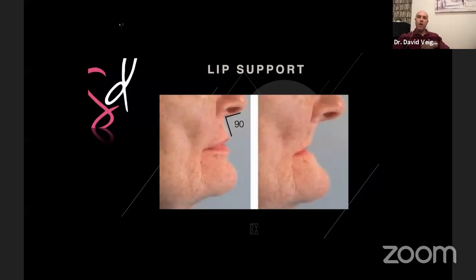And with all these changes, we want to make sure we've got the right lip support. We're going to have these edentulous patients that have severe atrophy to their alveolar ridges, so they're going to be needing proper lip support. If you haven't planned that in the tooth position first, and you plan your implants relative to where just the bone is, then you're going to have this overhang or step, this cantilever. Now, is that okay? Sure, that's acceptable if you can't put the bone back, or you're limited to that bone area, but you have to be aware of it. And I always mention to my patients that there's going to be this, or I try to augment it.